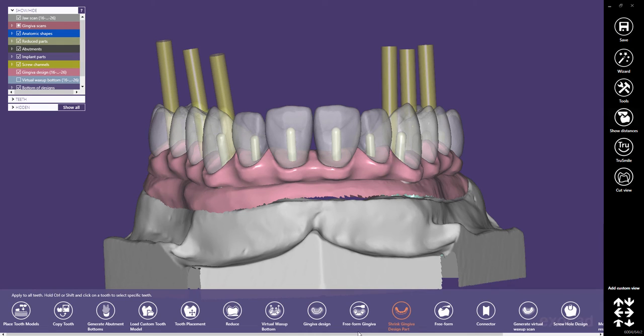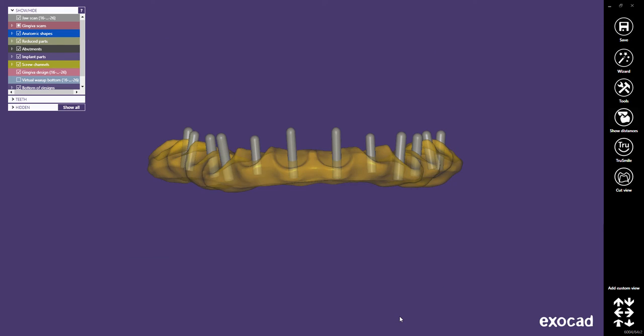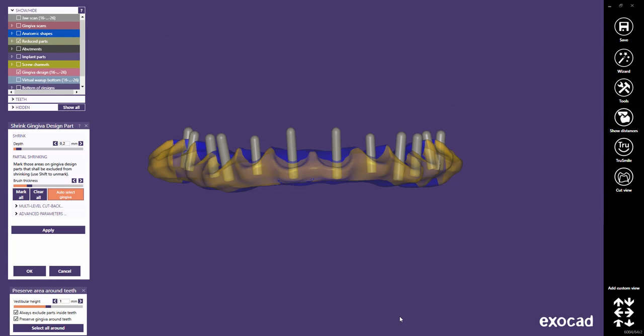Note that shrinking the gingiva is only possible in the expert mode. There are different ways to shrink the gingiva. This will be explained in a separate video tutorial. In our case, we simply want to shrink the entire gingiva.